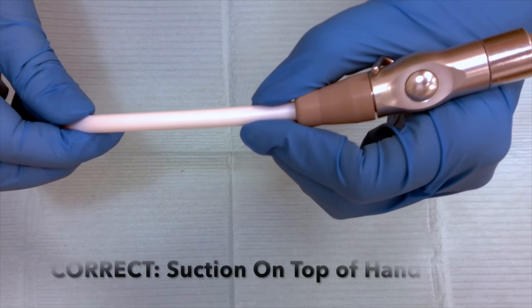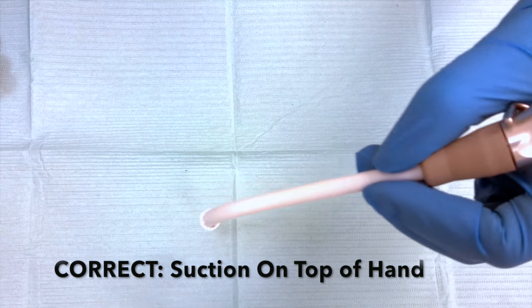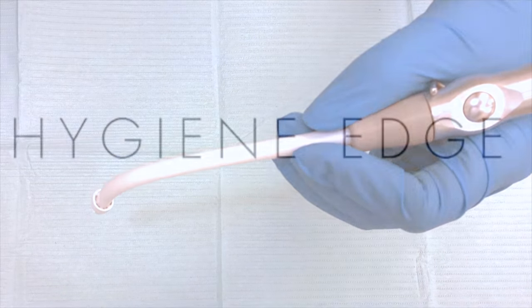The correct way is to actually use a modified C grasp where the suction is on top of your hands. This allows you to have a very neutral wrist and still be able to retract and suction in the manner that you'd like.